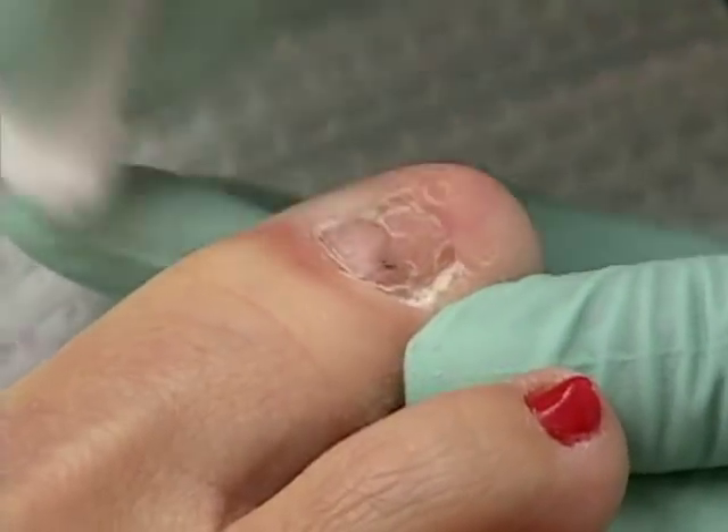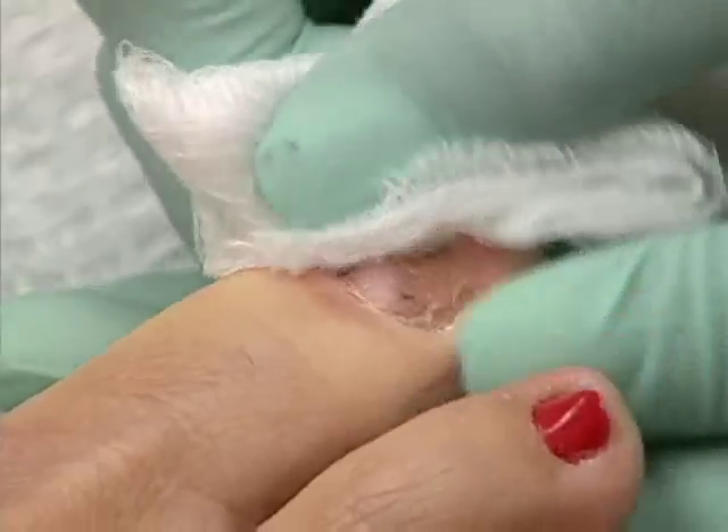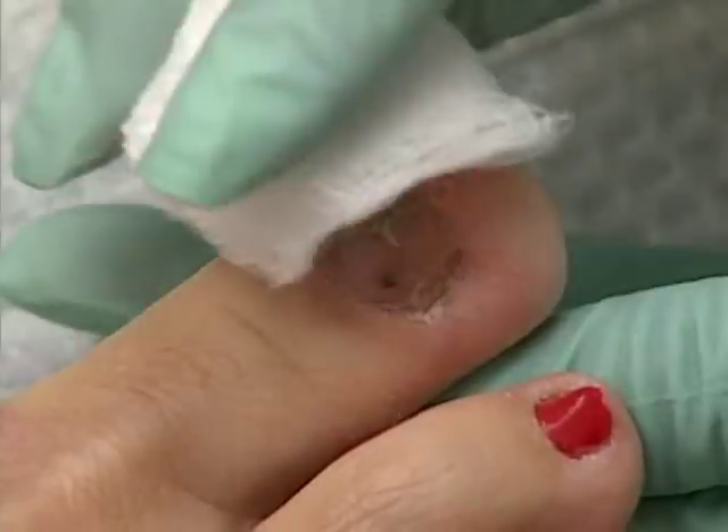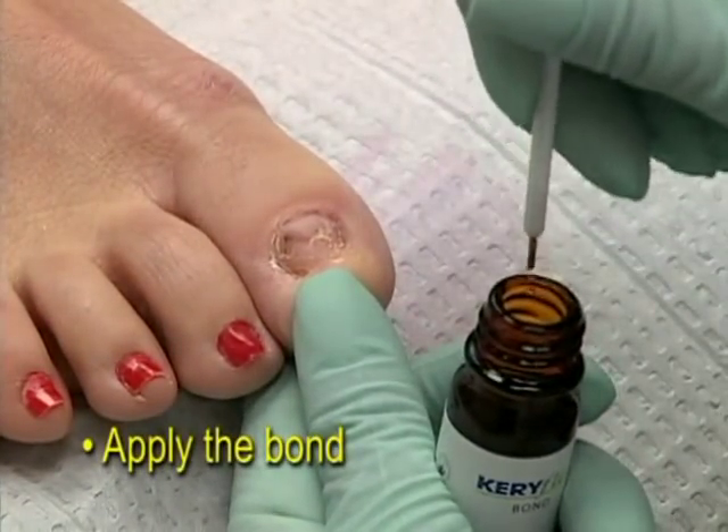After you have removed the damaged nail as much as possible, wipe the toe with dry gauze to remove any nail debris from the Dremeling. When the nail is free of debris, you next apply the Keriflex bond with a white brush included in the Keriflex kit.